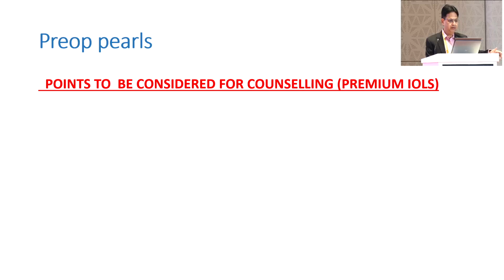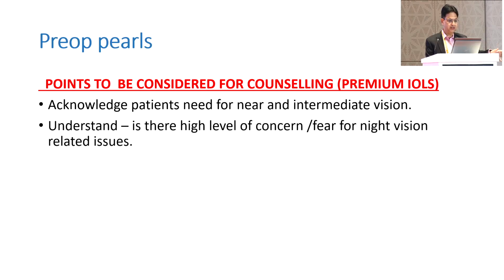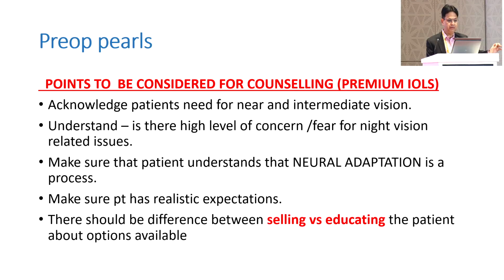In pre-op pearls, we acknowledge the needs of the patient, whether the patient needs near or intermediate vision, and understand whether there is any high level of concern or fear about night vision or related issues, as we know that lenses with rings will have some problems. Make sure that the patient understands that neural adaptation is a process, and that the patient has realistic expectations. There should be a difference between selling and educating the patient. This is the most important thing.